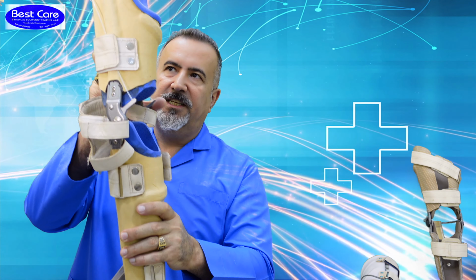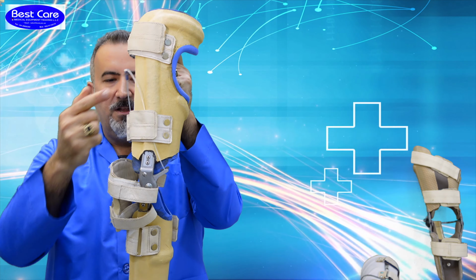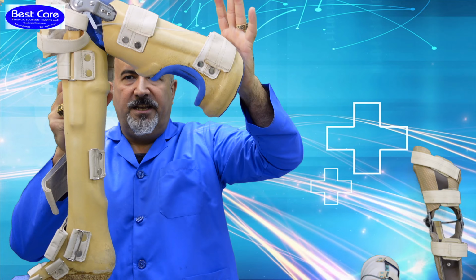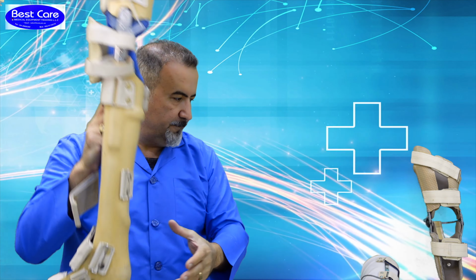The joint, you can see that it will be released by this cable here. You can flex it and easily the patient can use it. You can see it's locked now and easily opened. Okay? And again here there is no ankle joint.